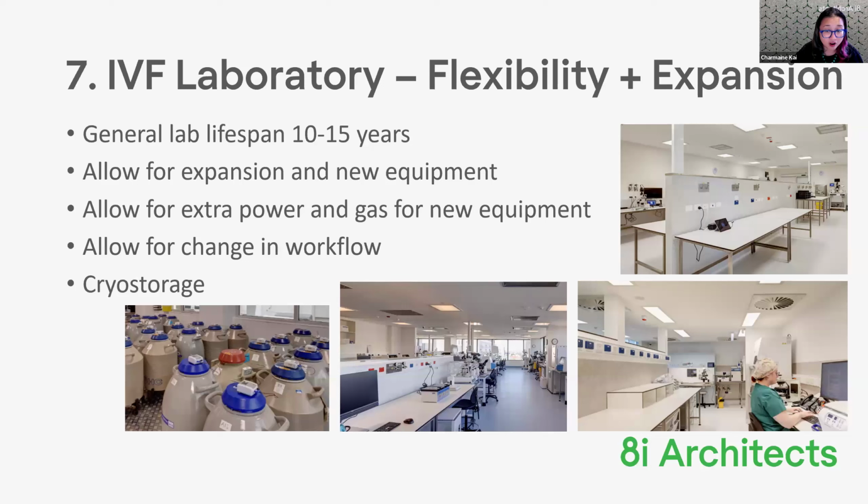In 15 years I've been doing IVF labs, they've all grown. Every single one has grown, and they've grown a lot faster than what they had predicted, simply because their existing facilities were hampered and it was actually restricting their growth. So please allow for them.